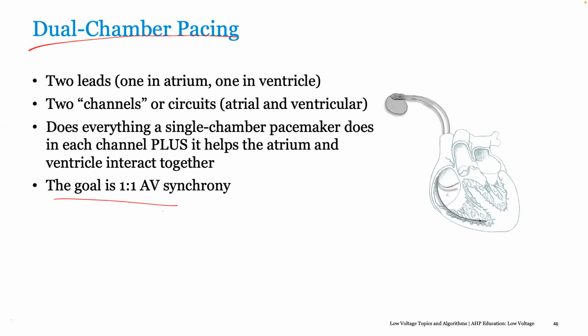I think what's important to understand, especially what Dr. Duffy was saying, is that given that most people in sub-Saharan Africa have complete heart block as their indication for pacing, the most basic form of pacemaker is going to be enough for these patients. You're not going to need any of the fancy things. You're just going to program DDD at 50, 60 perhaps, and let them sit like that for 8 to 10 years based on battery life, obviously.